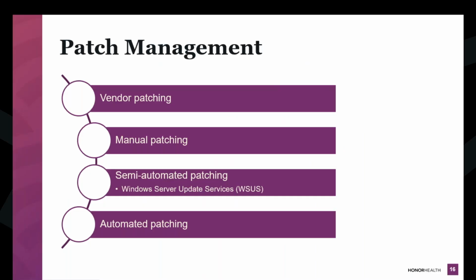Manual patching, meaning you're going to the device and you're deploying that patch to the system. Again, it's going to be very difficult to know what patch is needed for this system if you're doing it manually, unless you're just patching on a monthly basis, whatever comes out as far as updates, you apply those patches, but that's an option for you.